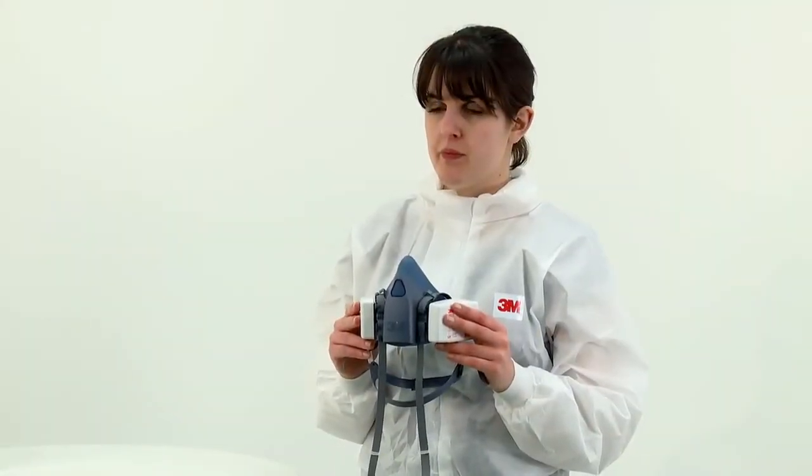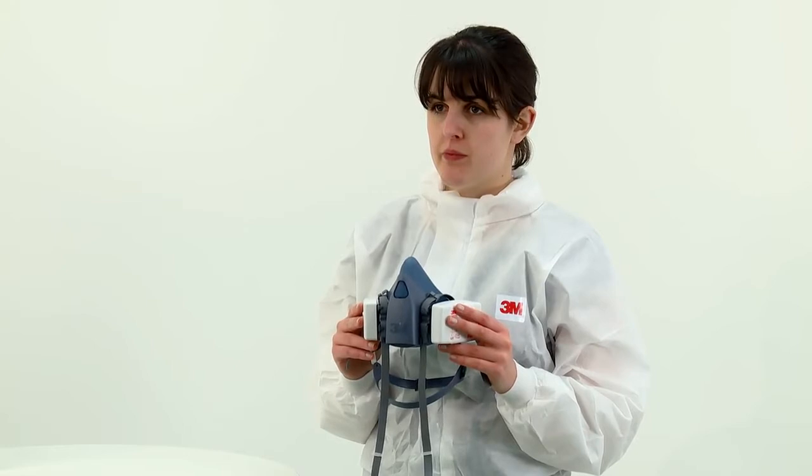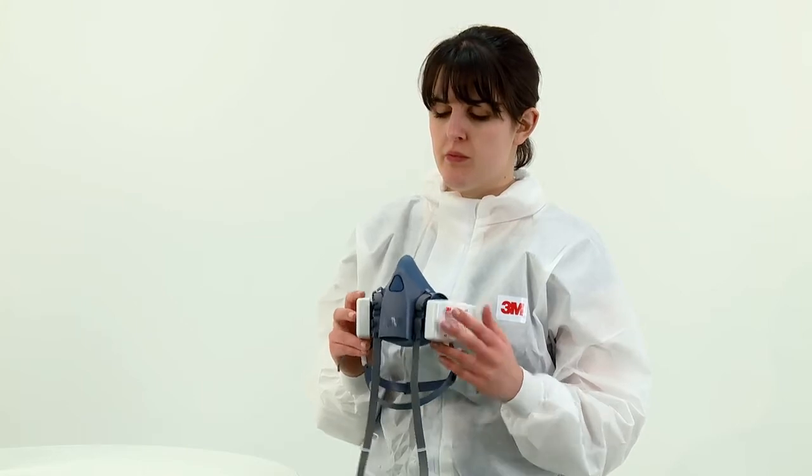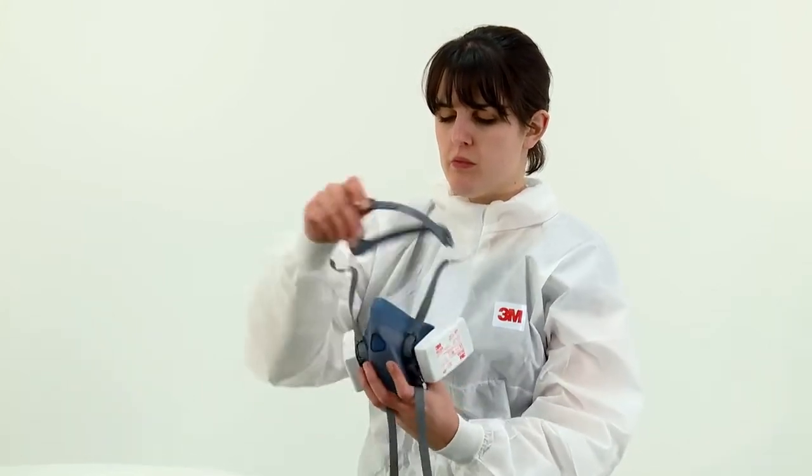The method of fitting the respirator to the face is the same regardless of which filters have been fitted until you reach the fit check. Place the respirator over your nose and mouth, fitting it comfortably on the bridge of your nose.